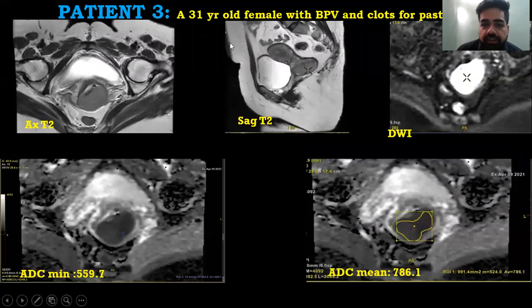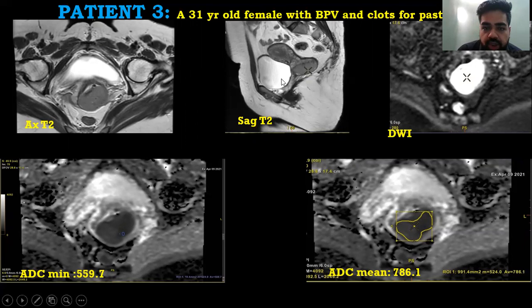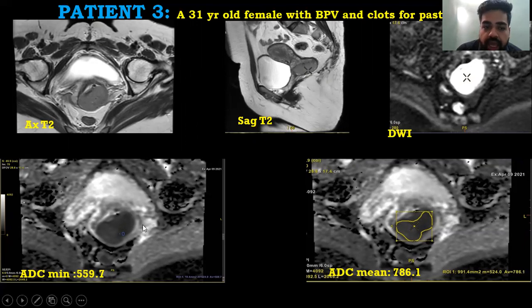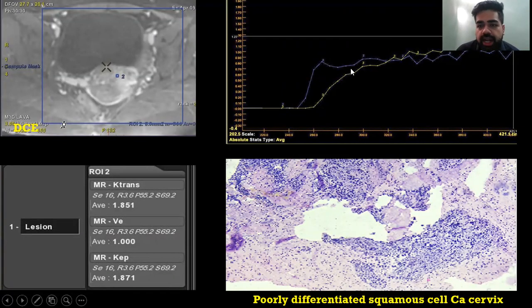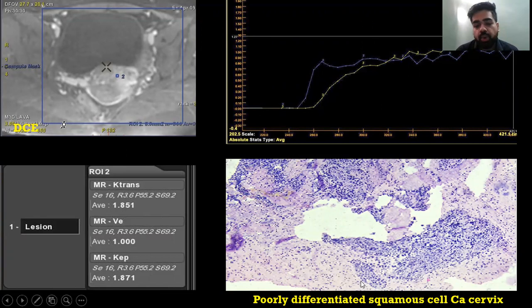Patient 3 was a 31-year-old female with per vaginal bleeding and passage of clots. Axial T2 showed a mass lesion involving the cervix. Diffusion-weighted imaging showed restriction. ADC minimum was 539.7 and ADC mean was 786.1. On dynamic contrast, the lesion showed early enhancement compared to the myometrium. K-trans was 0.851, and histopathology showed poorly differentiated squamous cell carcinoma of the cervix.